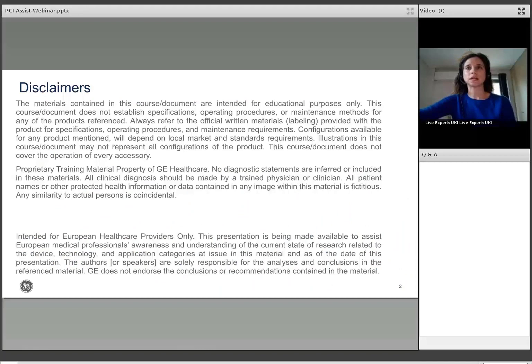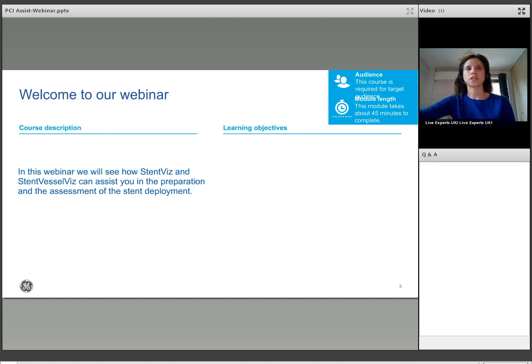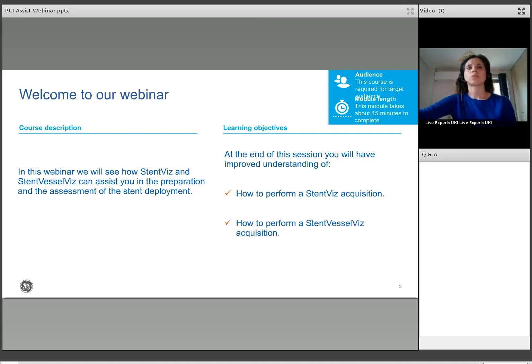I'm showing my disclaimers here, and then I will quickly go through the agenda of the webinar. The two main tools are StentViz and StentVesselViz, and these can assist you in the preparation and the assessment of the stent deployment. What we will cover now is the workflows, so how to perform a StentViz and a StentVesselViz acquisition, and then we will see what the clinical benefits of these tools are.